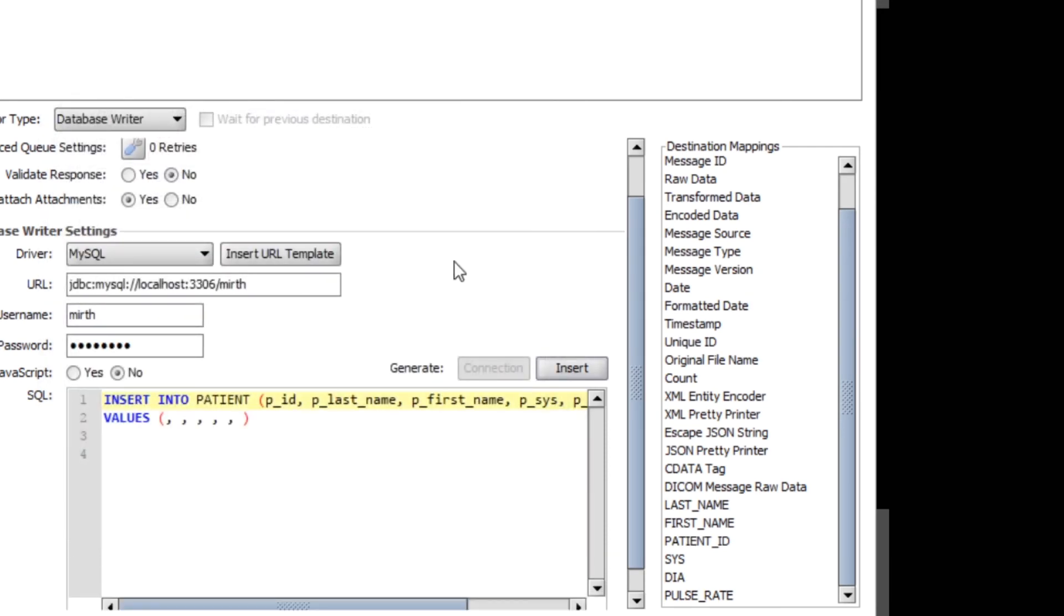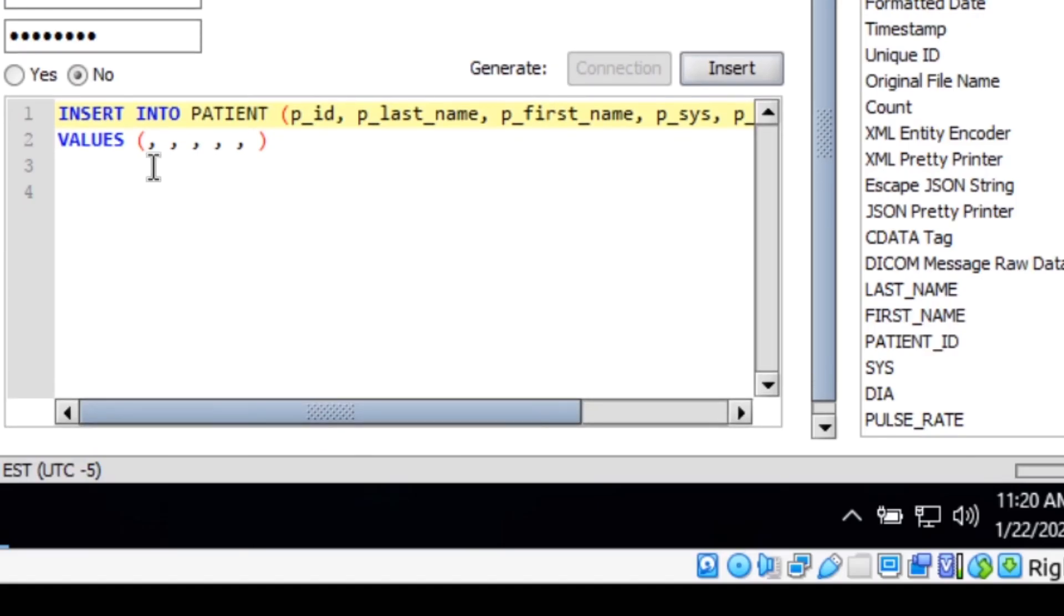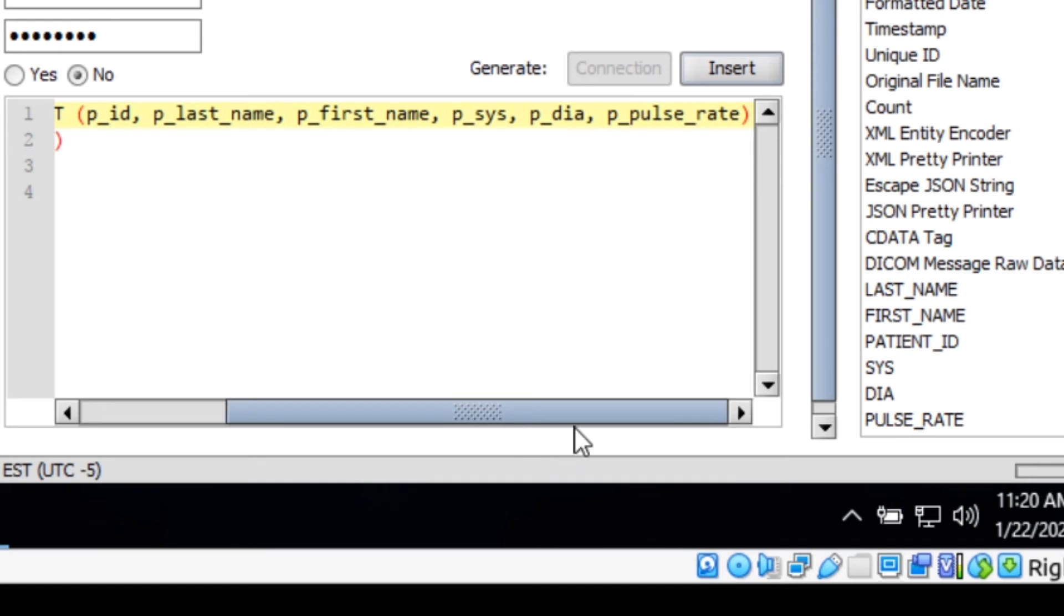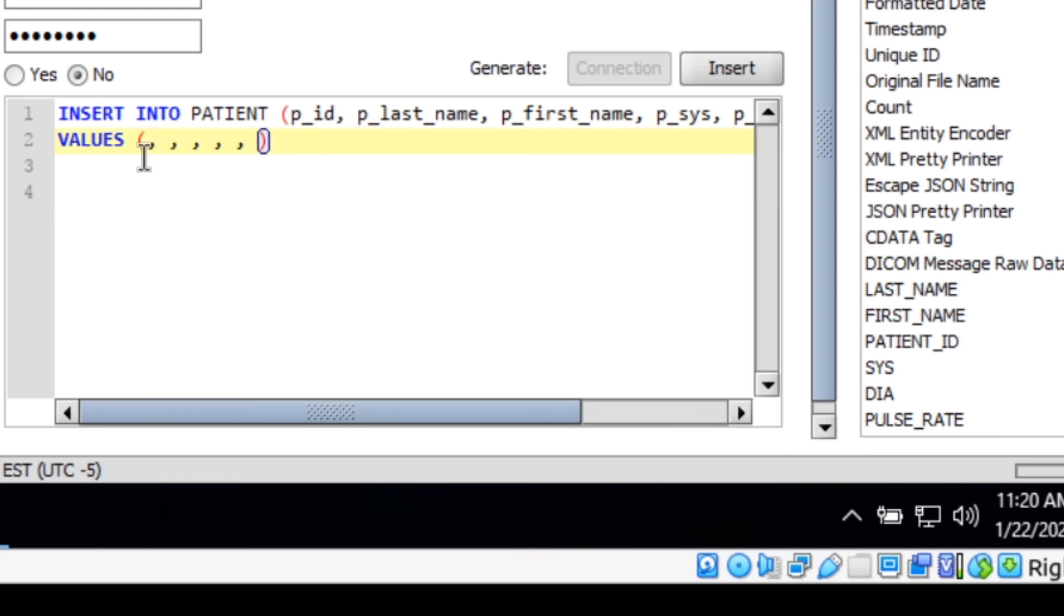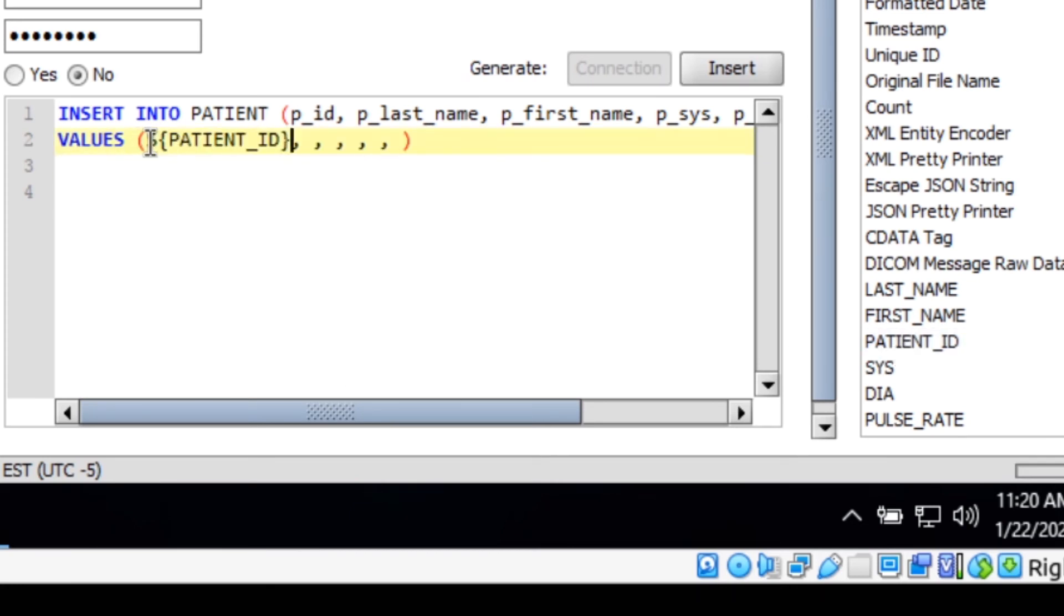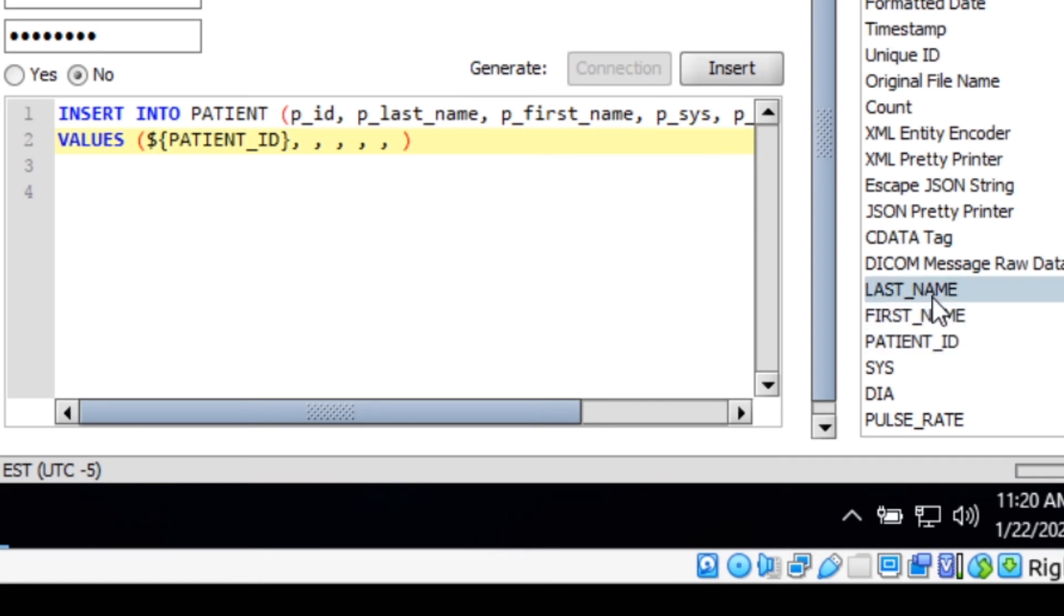Yeah, so that's what we have. So we click generate. And you can see our insert into patient and then the values that are stored. Now what we've got to do is fairly simple. We'll just need to match up the values in order into this right here. So click on just before the first comma, and it wants the patient ID. So we just go over here and click patient ID, and we can drag it right into there. I'm going to do the next thing for the next one. So we just click right next to the second colon here, and it wants to have the last name. So we just click and drag last name right up here.